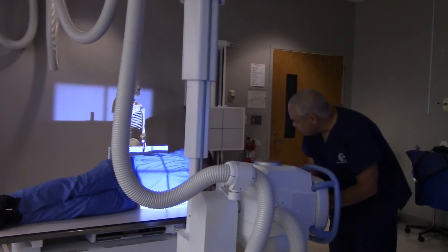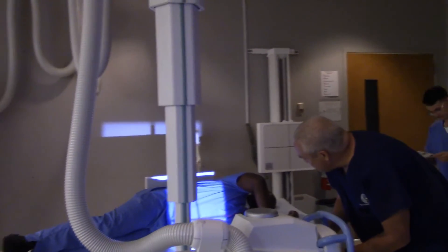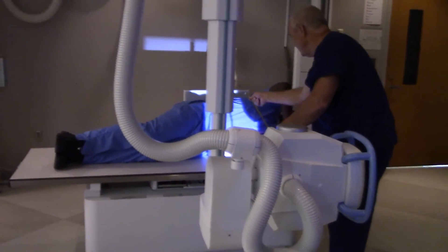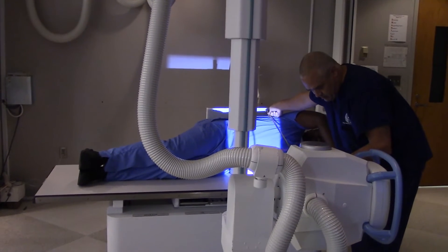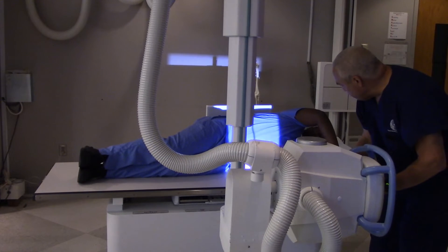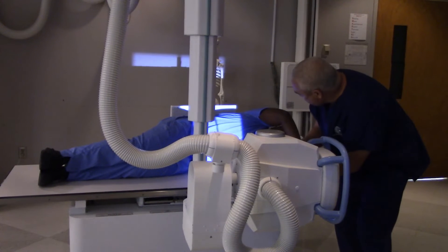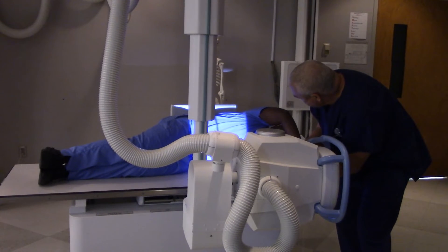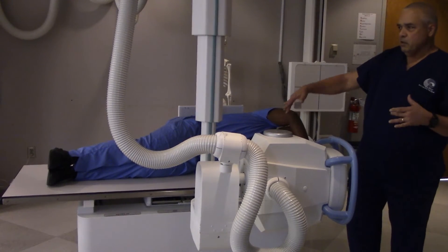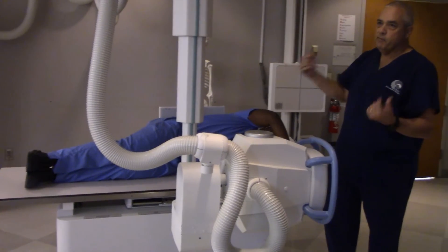Now what kind of SID do I need? 40-inch minimum. Right there is about 52 inches, so I'm going to go in a little bit more. It doesn't have to be exactly 40 inches. Remember, we're doing this decubitus cross-table, so I don't have to worry about my interlocks or being exactly 40 inches off the table before I can make an exposure.